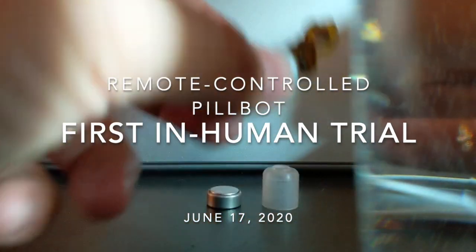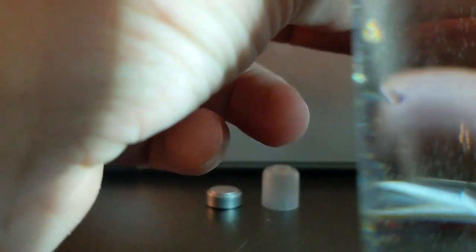Hello, folks. We are going to assemble a robot. Okay, ready? Alright, and go.